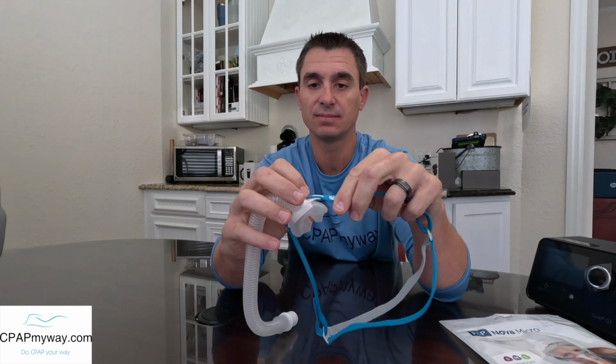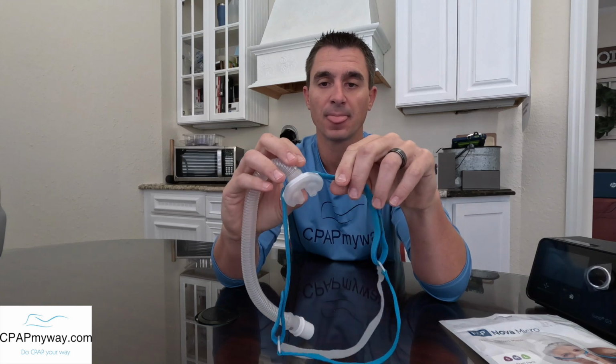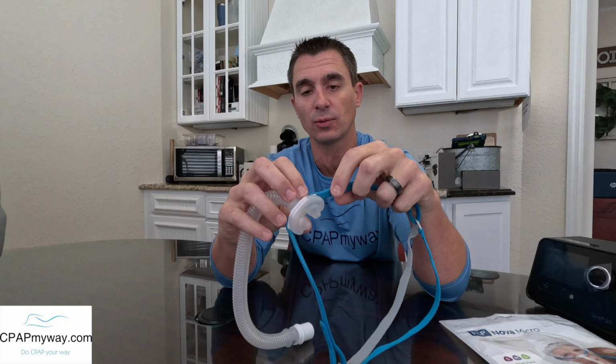And the final thing I want to point out about the headgear that you're going to want to consider is taking the headgear on and off. As far as maintenance goes, I'll discuss it in a second, but you're probably not going to take the headgear off all that often, and I would discourage you from doing it too often on this mask, because I think the more you pull on this thing, the more there's a chance you're going to wear it out. Maybe not, we've only been doing this for a little while, and we've put it on 30 or 40 customers so far. And I've been using it off and on for, I guess, a couple of weeks.